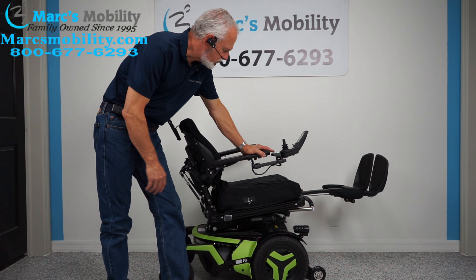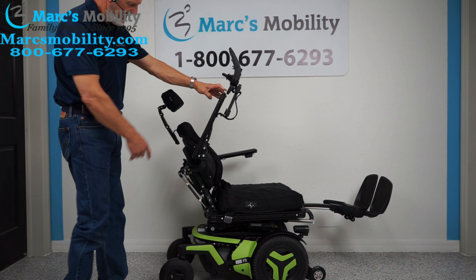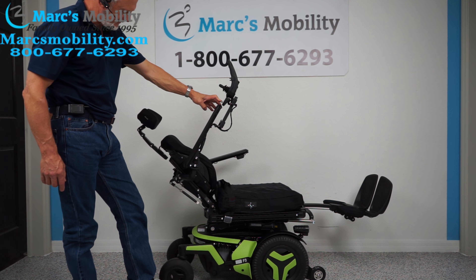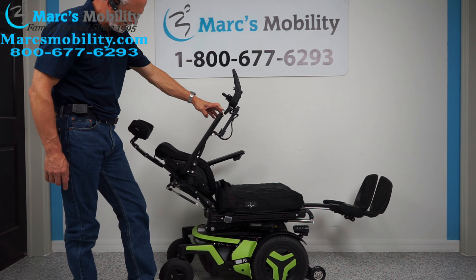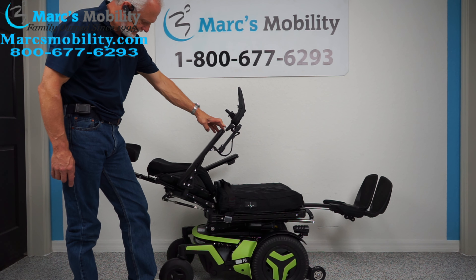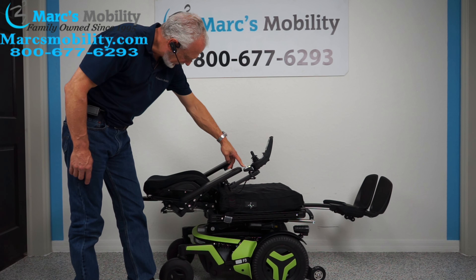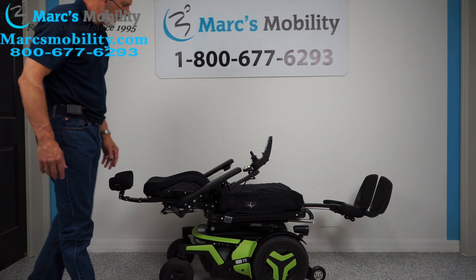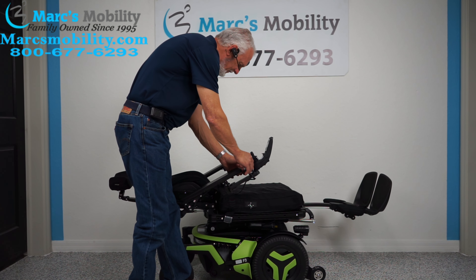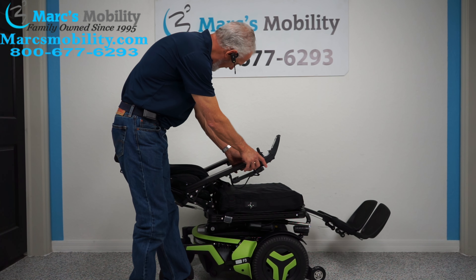The next feature is called the electric recline. The electric recline is when the back goes back by itself — you can see the back going back by itself. It's a full recline, all the way flat. I'm going to bring the back up and the legs down at the same time, doing two buttons at once here to save time.